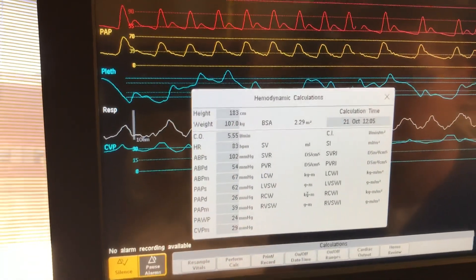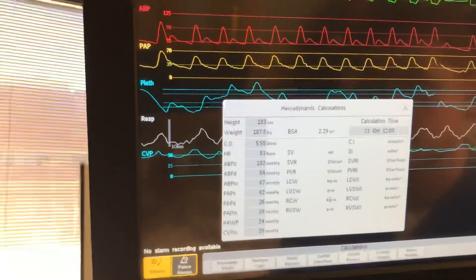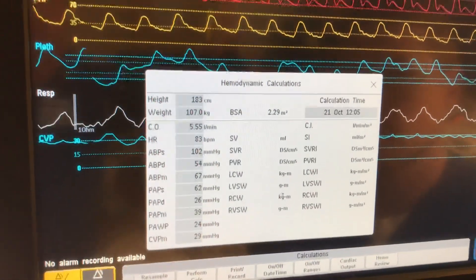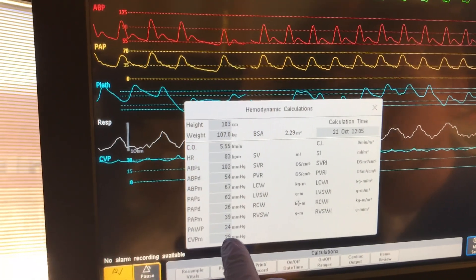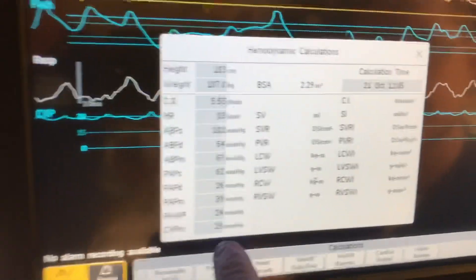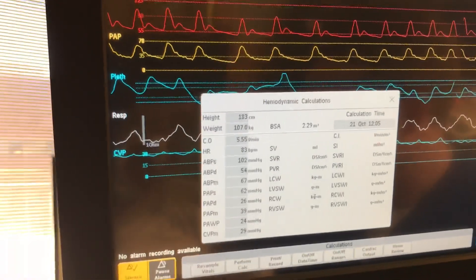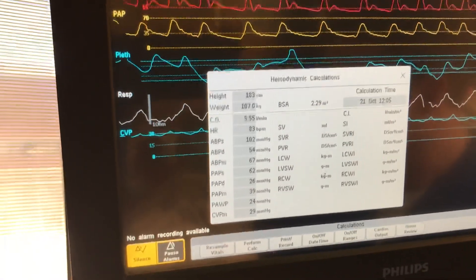Well, let's go back to it again because it was so fast. Did it already? It is your average — 5.55. So then our CVP. Did you write down what our CVP was? Or we can — if you want to open that back up. We can put our CVP. Yeah, so why you got — why you're clamped here.